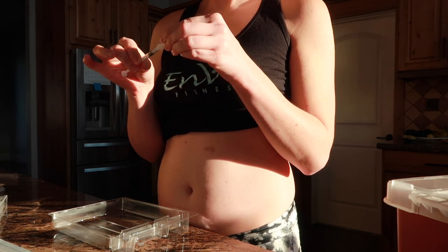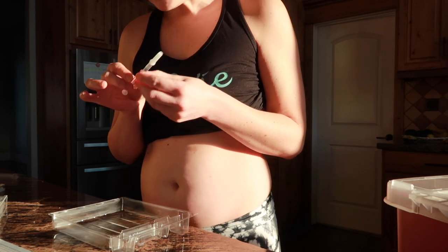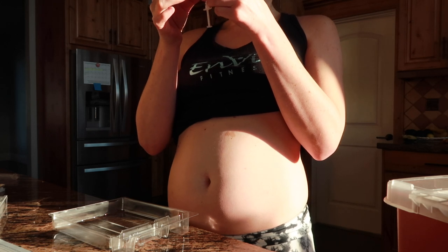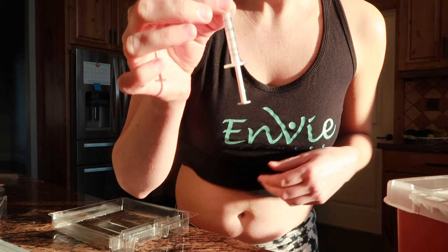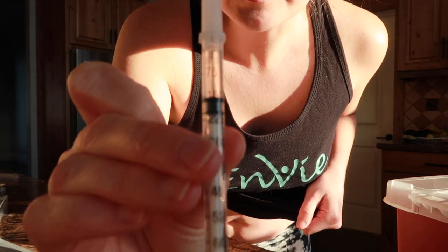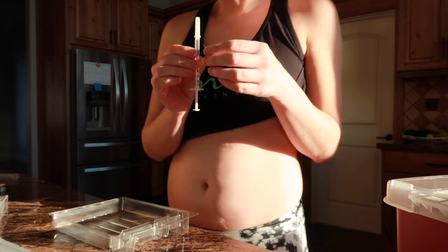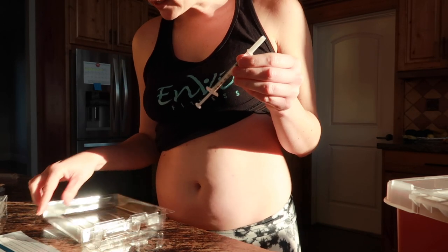Remove the syringe and recap the needle. I see a little air bubble in there — I hope that doesn't matter. The lighting here is terrible but whatever. You know what, I'm not going to wait for Josh, I'm just going to do it. This is ready.